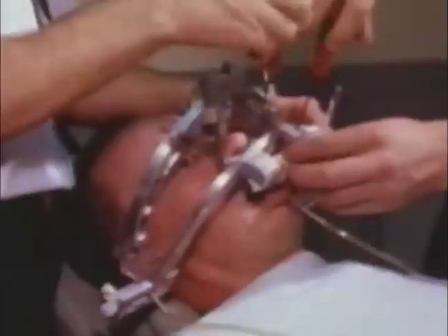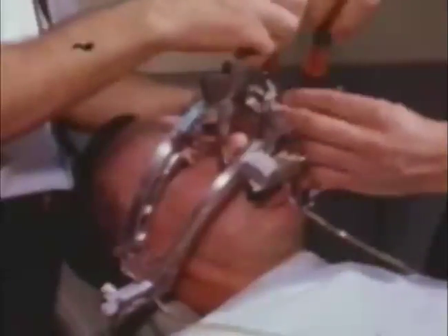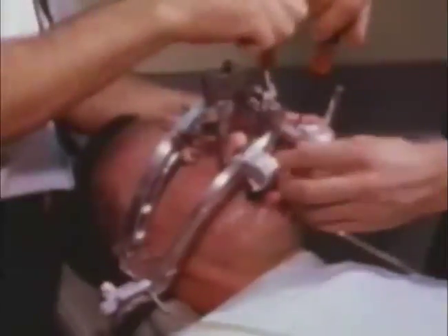The anterior reference pointer is adjusted and secured to the orbital spot on the right side of the nose. Note that the orbital spot has been marked temporarily with dark ink for photographic clarity. The recording equipment is removed from the patient by loosening the attachment clamps.